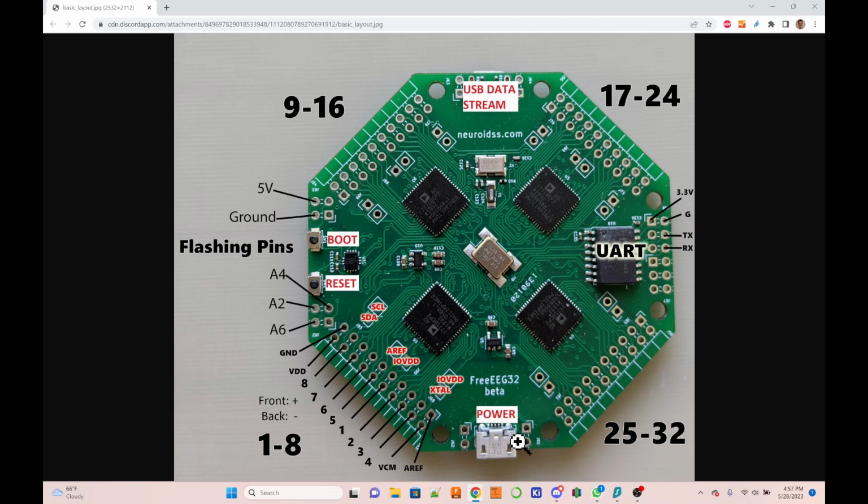So it's this split system of two USB cables. Although it's a nuisance having two USB cables, this is one of the things that makes this a quality system, because you have a complete separation of noisy power. You have the ability here to power your board with a completely noise-free power source, which is a power bank, and then on your data cable there's no power supply, so the noise from that cable doesn't enter the board. And so on the other side of the board, there's the other micro USB cable here, which is only data. So that one you plug into your laptop or into your Raspberry Pi or whatever you do. And of course the board doesn't function without power, so you need both of them.